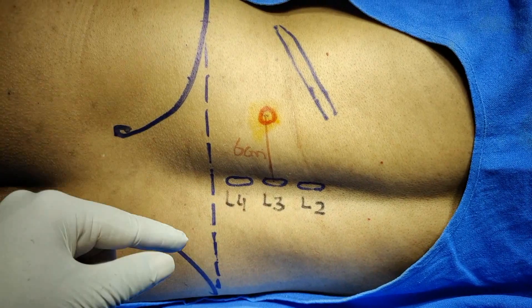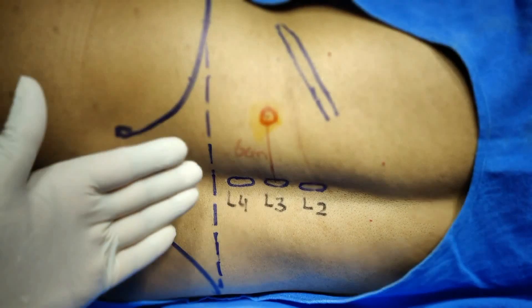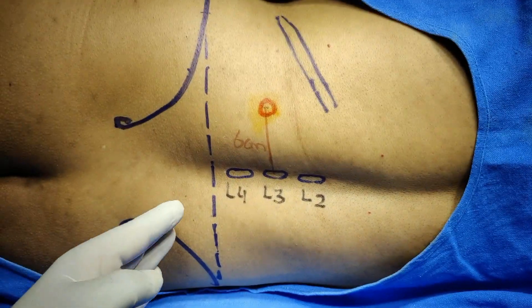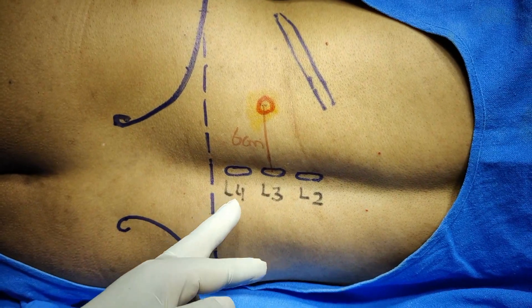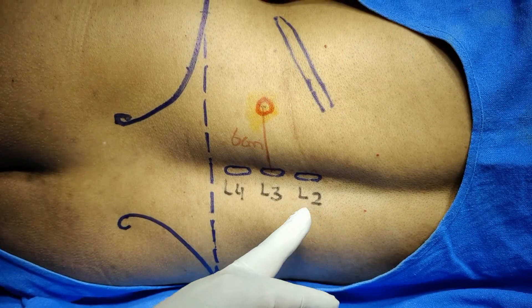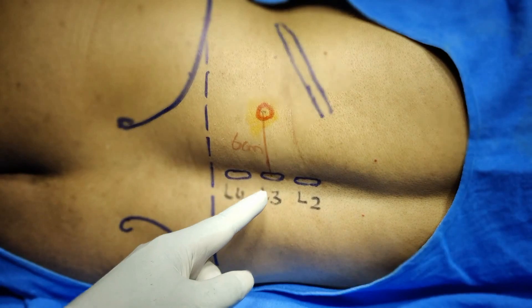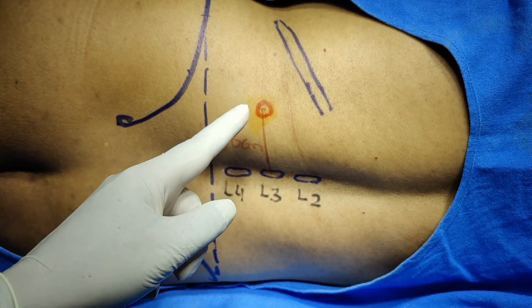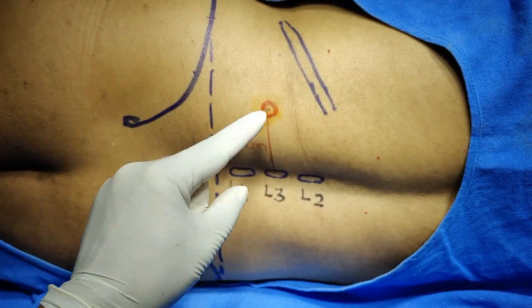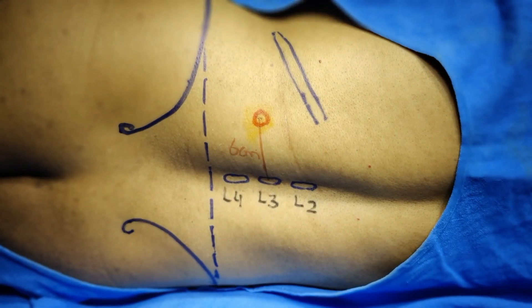I have marked certain landmarks. This is the posterior superior iliac spine on both sides, and this is the top of the iliac crest. We have drawn a dotted blue line that passes between L5 and L4. We have marked L4, L3, L2, the spinous processes of the lumbar vertebrae, and the twelfth rib. We have taken a point 6 cm from the midline, roughly between these two landmarks. This is the entry point for the lumbar sympathetic block.